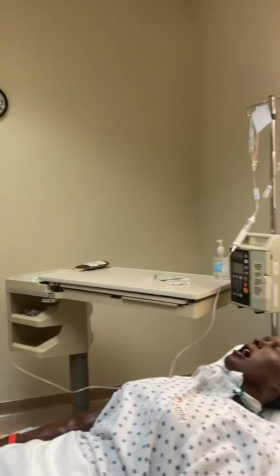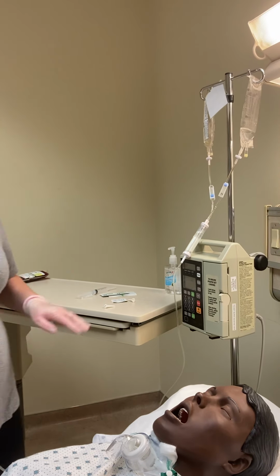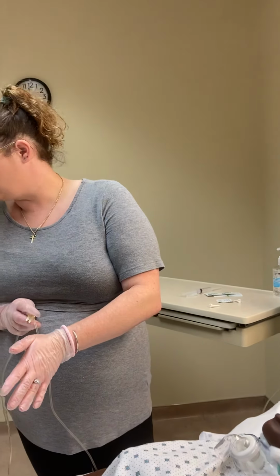I'm going to stay with the patient for those 15 minutes, and I'm going to monitor their vital signs after 5 minutes, after 15 minutes total, after 30 minutes total, after 1 hour total, and then every hour. However, follow whatever your facility's policy is.